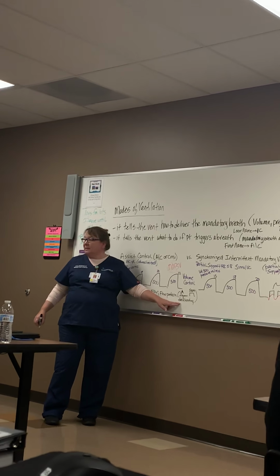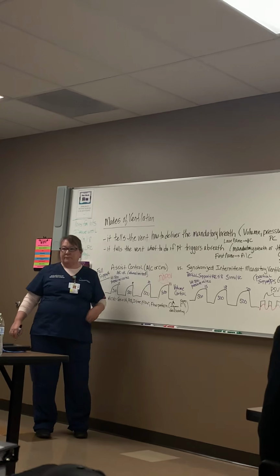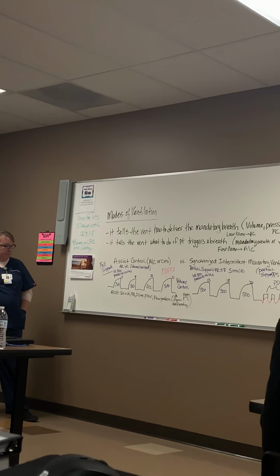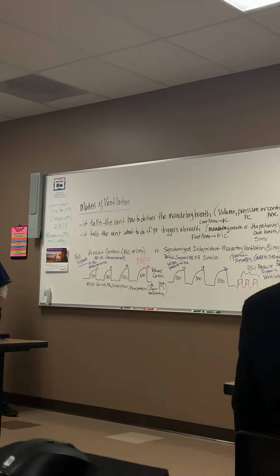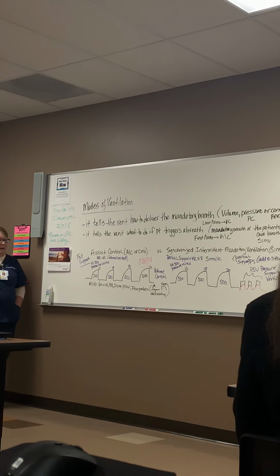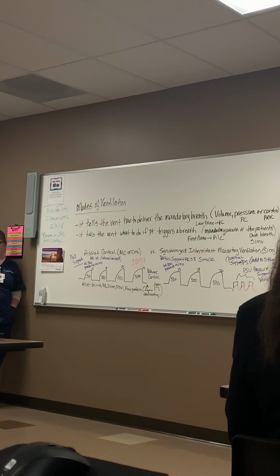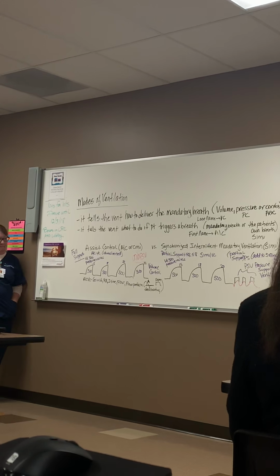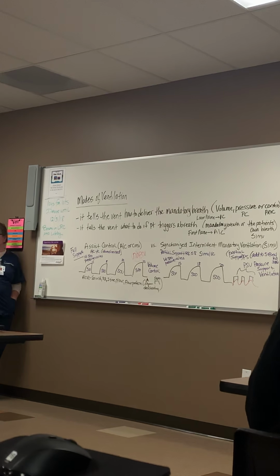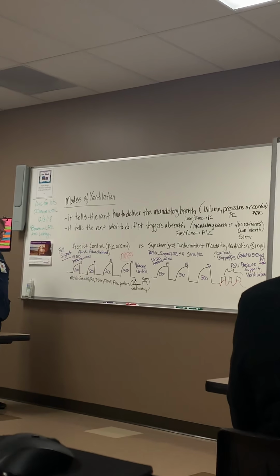And on our bench, you can only set it on the G5 and the PB. Can't set it on the other ones. On the servo and the Draeger, you can't change it. It just defaults to whatever it defaults to. The decelerating is more of a normal breath, more comfort, and it's better for gas distribution, so it's just the best.